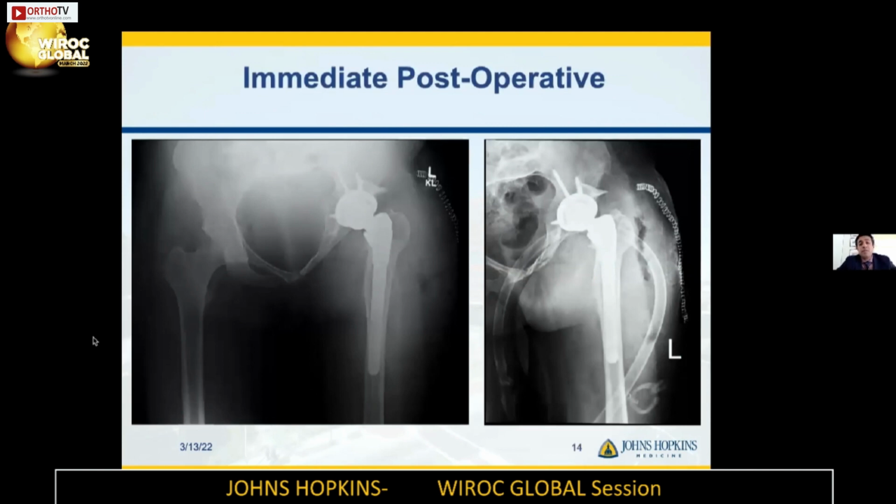Postoperatively, this is her immediate postoperative X-ray. So we used a size 48 millimeter DePuy Pinnacle multi-hole cup. We really preserved that shelf osteotomy to try and engage that superior aspect of the cup to prevent further proximal migration.